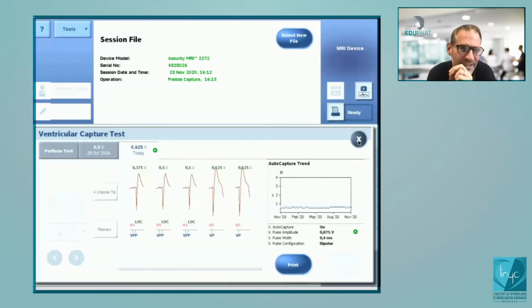And something here at the level of the ventricle, it will not modify the pacing rate. It means that, for example, in an ICD, many patients are programmed in VVI 30 beats per minute, not to pace, just to respect the spontaneous activation. If the patient is programmed at VVI 30 beats per minute, and if he has a spontaneous rhythm, then you will not have the possibility to test the thresholds at the level of the ventricle. Okay? So if you close.